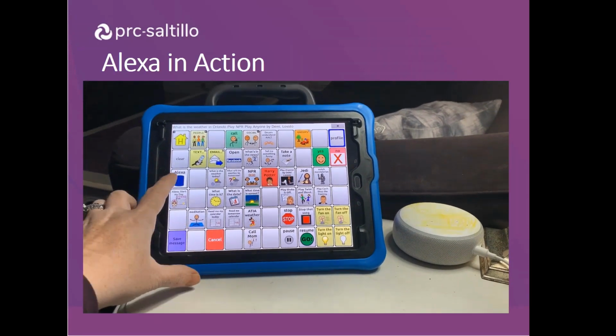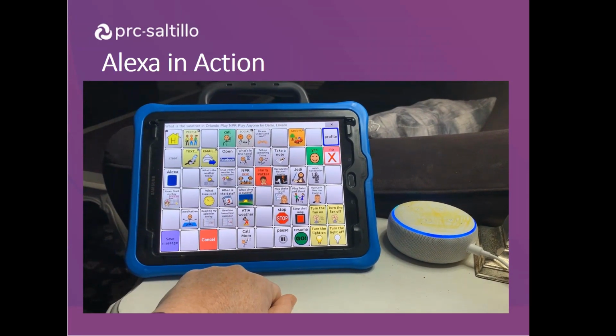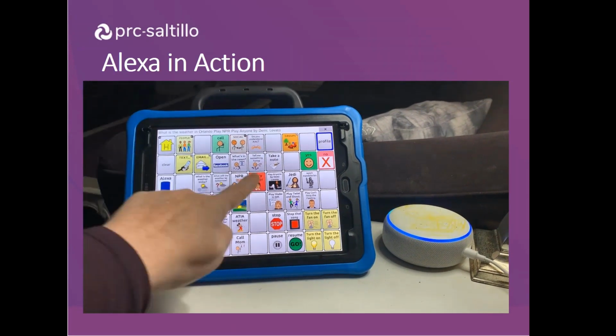Alexa, stop. Alexa, read Harry Potter and the Sorcerer's Stone.